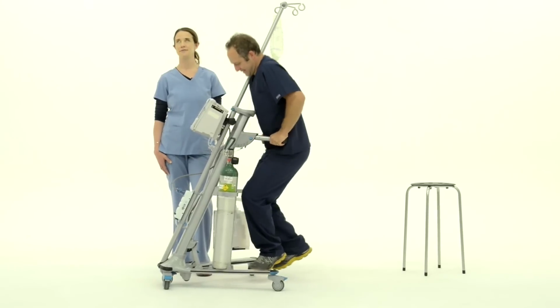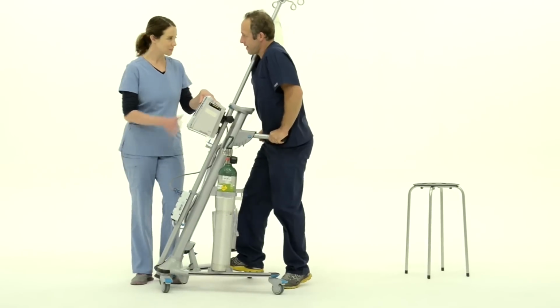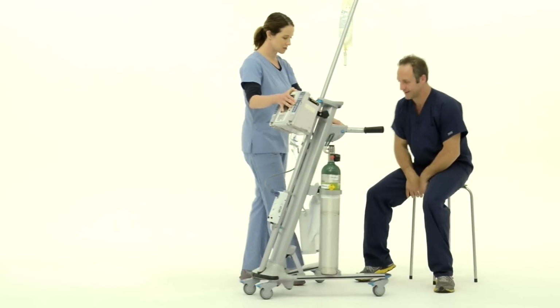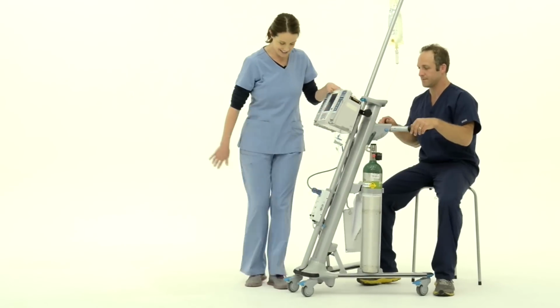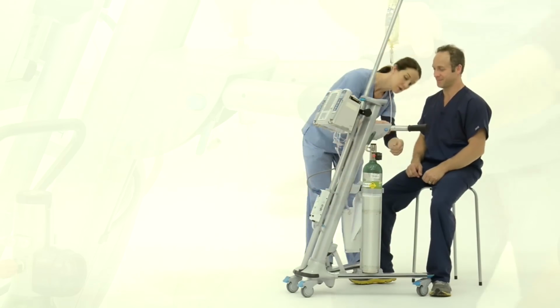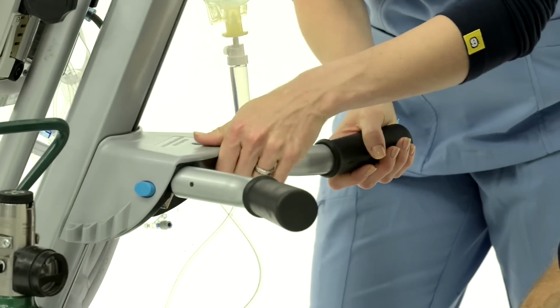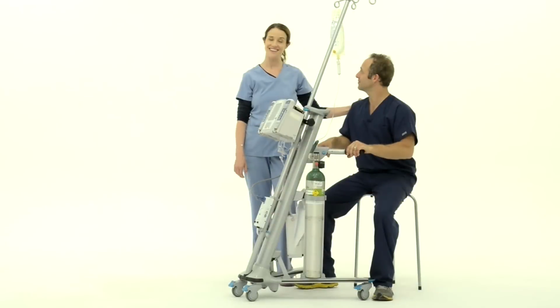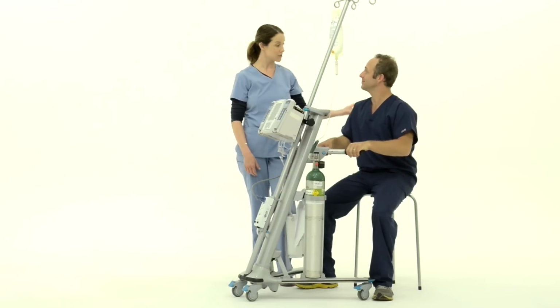Yep, keep going here. So, to help your patient up, you want to position the IVEA alongside the bed, set the front brakes, and then lower the handles. There's another quick release right here, so you can easily adjust the height. That way, your patient can use the IVEA to help themselves up with your assistance.